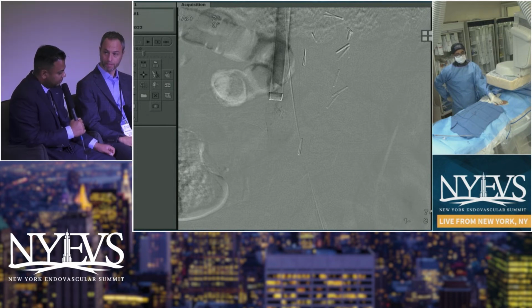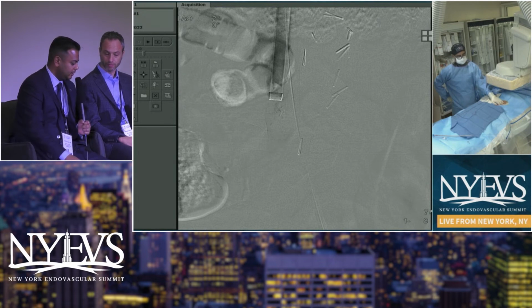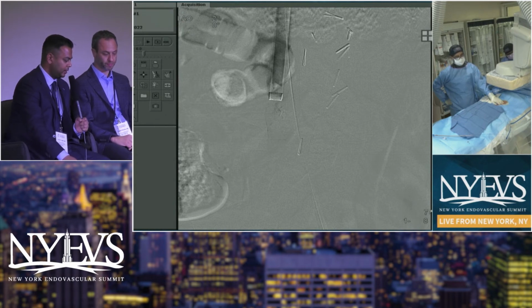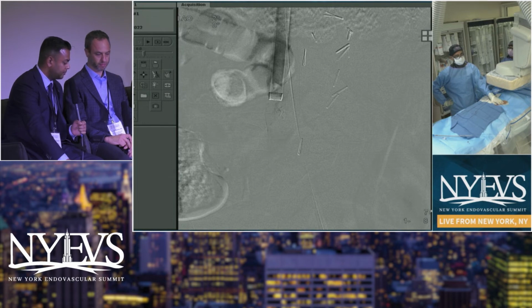So my personal experience with filter retrieval has been that usually if there's going to be a complication, it happens on the table. It doesn't happen in a delayed manner. And if a complication seems to have occurred in a delayed manner, you might have not quite seen something. I'm not saying that that's the case. It's just been my experience. But in general, if it's not my device and it's been in over 6 months, get a CT scan, make sure you know exactly what you're dealing with, make sure you have everything on board, you've planned out your anesthetic plan, and that you have your bailout tools nearby, because a ruptured cava needs to be dealt with very quickly.